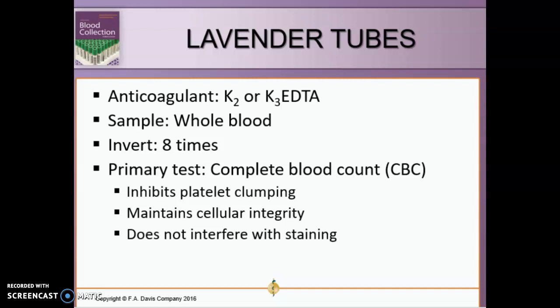Hey guys, today we're going to talk about the lavender tubes. We're going to talk about the different tube colors. We're going to start with the lavender tube. We're going to go through the colors, what they're for, the sample type. There's much that you guys need to know.